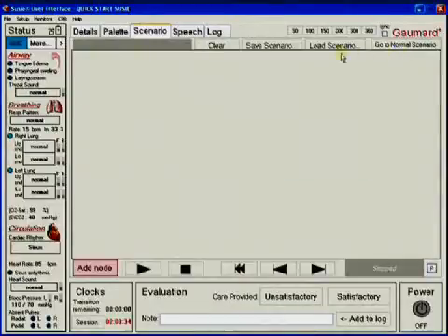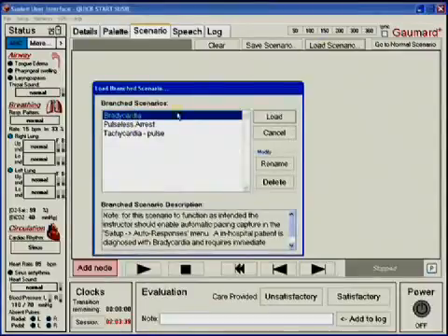The branching scenario is the most advanced method of running the SUSI simulator. This option gives the benefit of the if-then type scenario. The branched scenario provides multiple paths for the scenario to follow, and the actions of the care provider generate key events driving the path of the scenario. The instructor can check off the corresponding events on the software, enabling the scenario to follow the correct path.